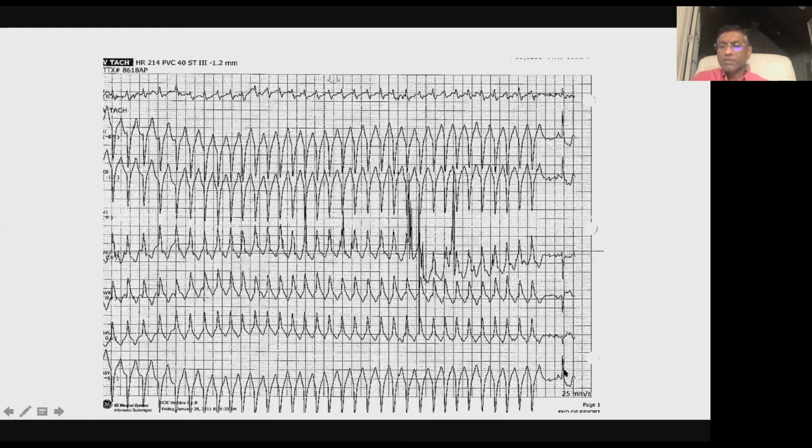Yes, sir. All right. And in front of it, lo and behold, there's a pretty good looking P wave over here. You see that? There's a nice P wave right in front of it. So here's a nice P wave and here's a good QRS. Now we know what this gentleman's normal looks like. That's his P and that's his QRS.